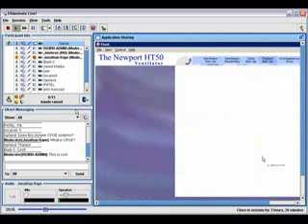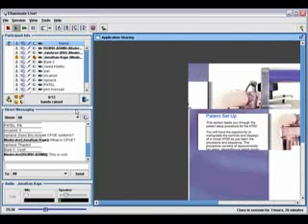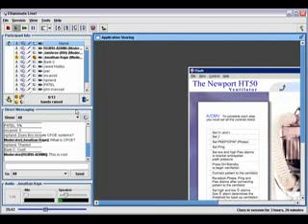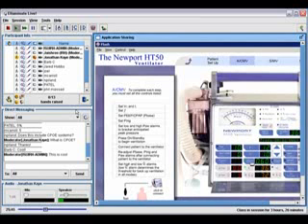Then in terms of the assessment, they may have a separate area where we actually set up a patient. They use their checklist essentially in assist control here, where now the person has to set up the machine according to the specifications, essentially the doctor's orders. And you can see along on the left-hand side, we're getting little check marks here. This is still a very controlled atmosphere, but it lets them practice their protocols, connect to the patient, all these types of things.